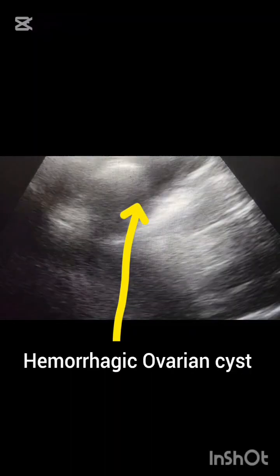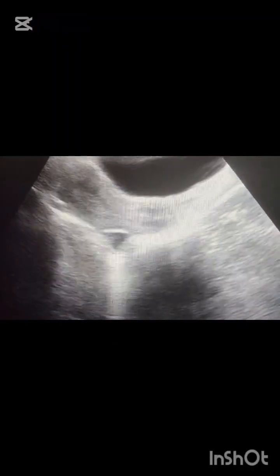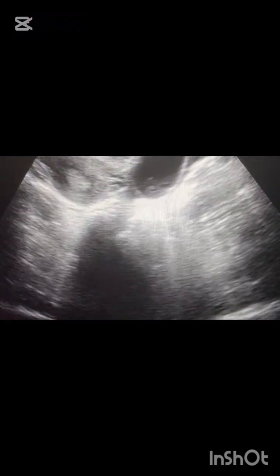Why is this a hemorrhagic cyst? It shows internal echogenic material within the cyst. So this mostly indicates a left ovarian hemorrhagic cyst.